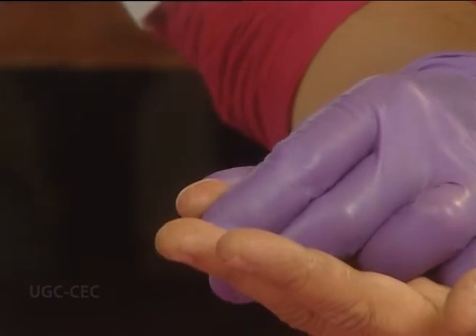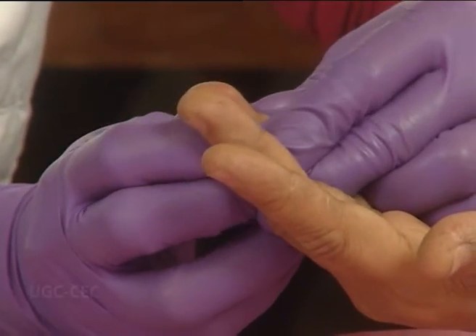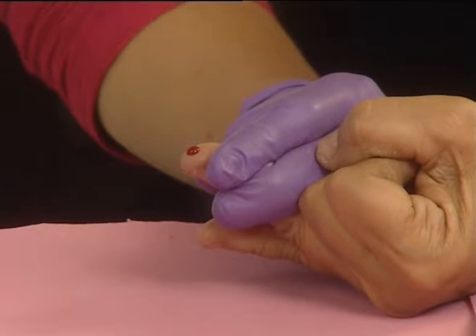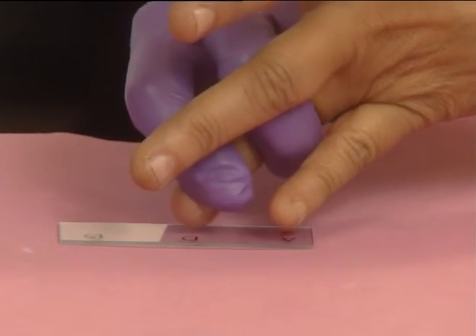Wipe off the first drop. Massage the finger from the bottom to the top to encourage blood flow. Press the blood towards the fingertip. Place 1 drop of blood on each of the marked slides.